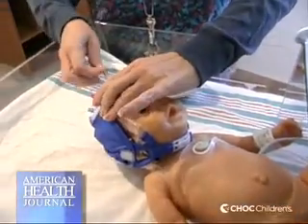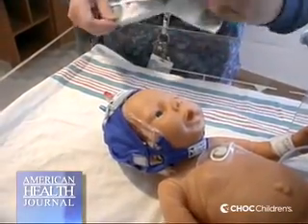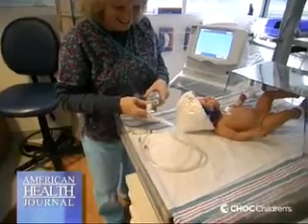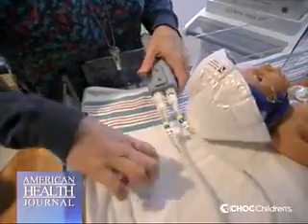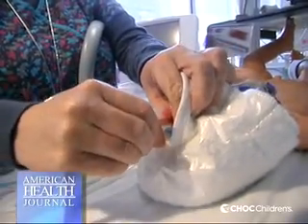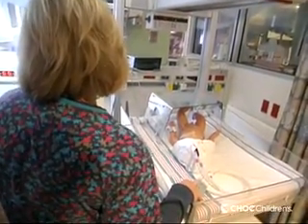Once we have initiated cooling in the first 6 hours of life, then the cooling has to be continued for 72 hours. After the 72 hours of cooling, the baby can be rewarmed over the next 4 hours, with a slow, progressive increase in temperature to re-establish normal temperature. And timeliness of this therapy is critical. It has to be offered in the first 6 hours of life. So the babies, if they're born at other locations, have to be transported with this condition as early as possible, and that would have a definite influence on a better neurological outcome for these babies.